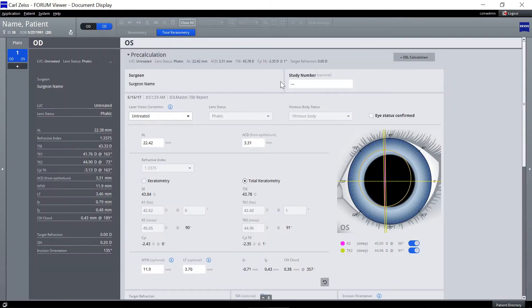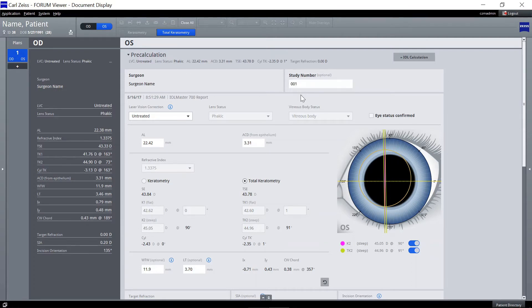You may enter a study number for the patient. The pre-calculation screen pre-populates with the latest available Zeiss IOL Master measurements.